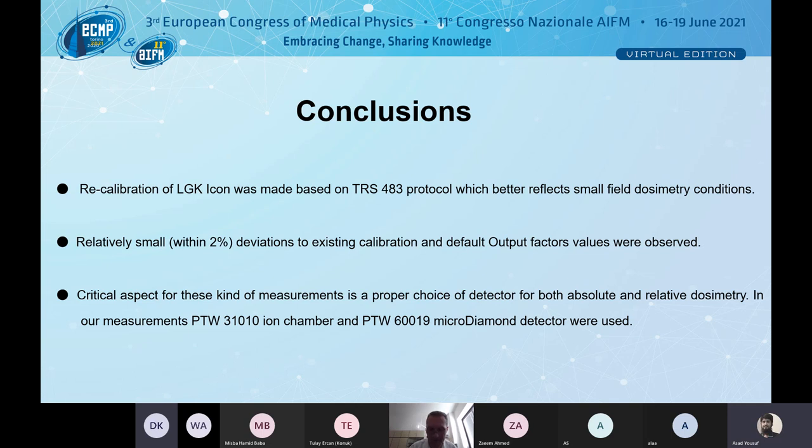Okay, I want to know whether it is only applicable for CyberKnife, Gamma Knife, and Tomotherapy, or is it also applicable for Linac based SRS systems? I am not a Linac guy, but as much as I know, you should have those, especially the FFF, Filter Free, triple F beams. There should be.